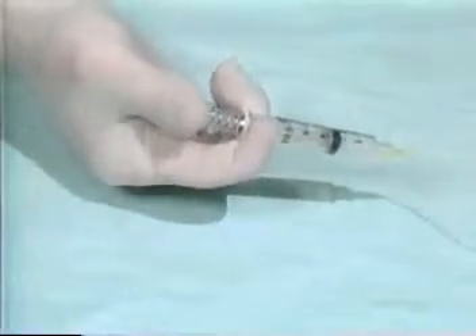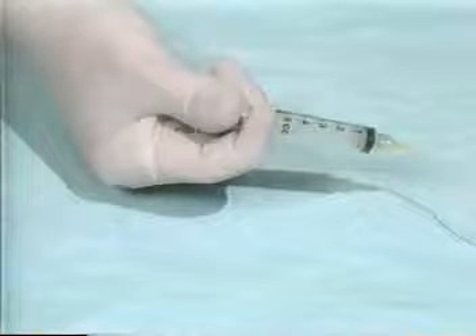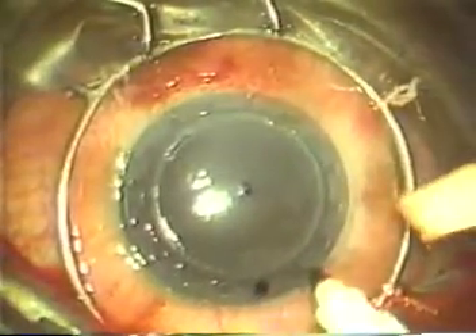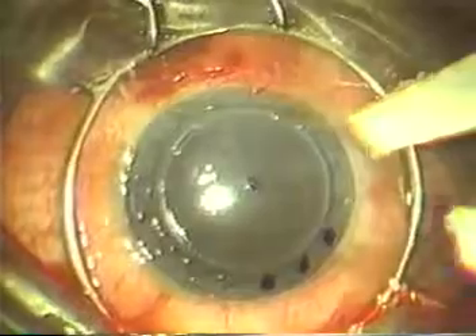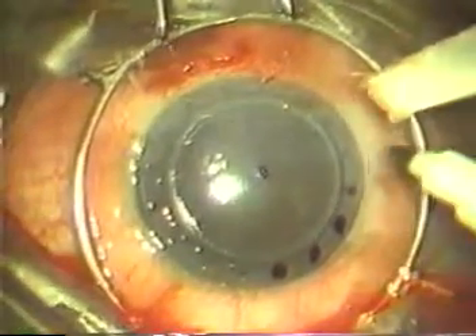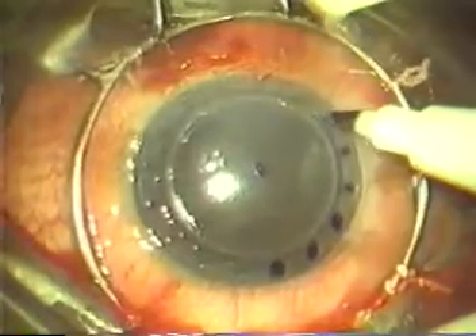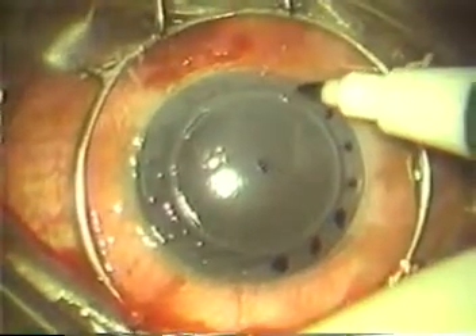After the cut has been made, the trephine is removed from the cornea by pushing the plunger of the syringe in all the way, which releases the vacuum. The anterior surface of the recipient cornea is then dried to reveal the 16 radial impressions made by the trephine, and each impression is marked with a surgical marking pin containing gentian violet ink.